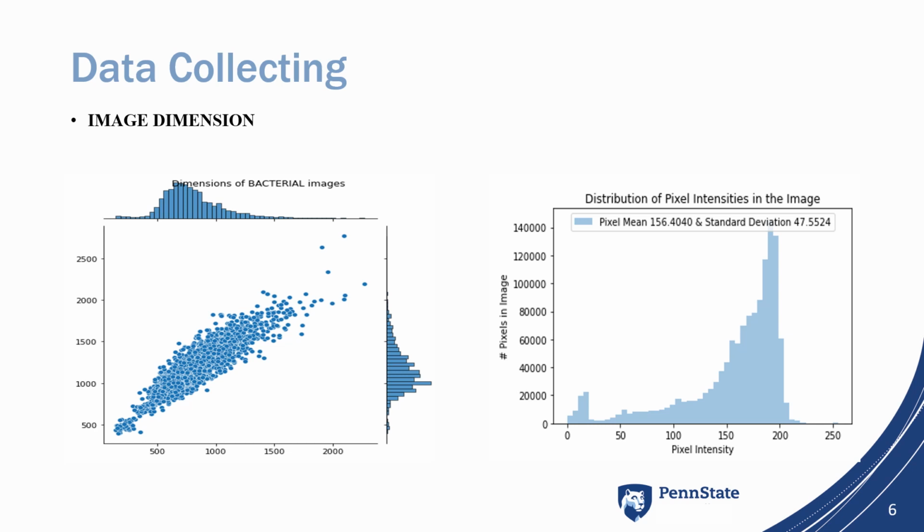We can also see in the plot that the highest pixel intensity is in the range of 180 pixels. We can see that the high end of the plot is at 200 pixels, so we will try to use this shape to be applied to our data.